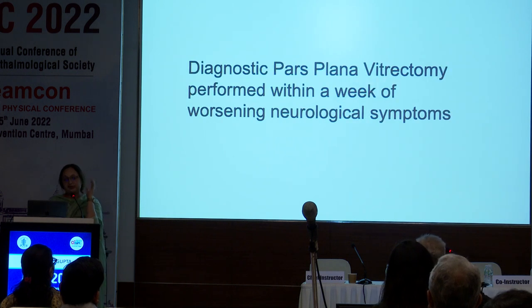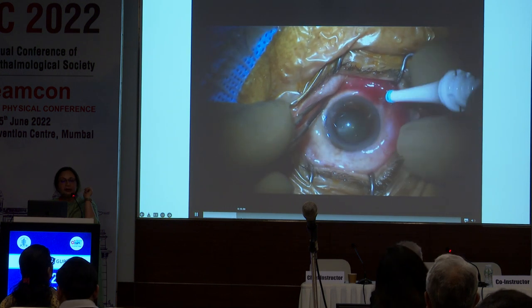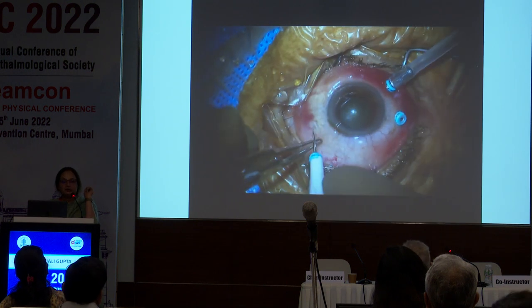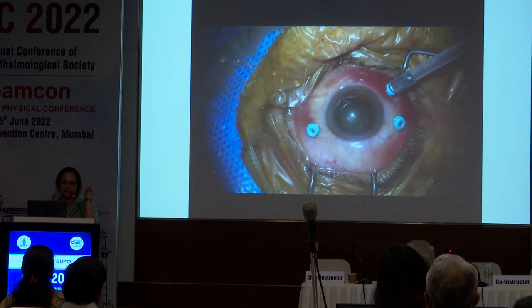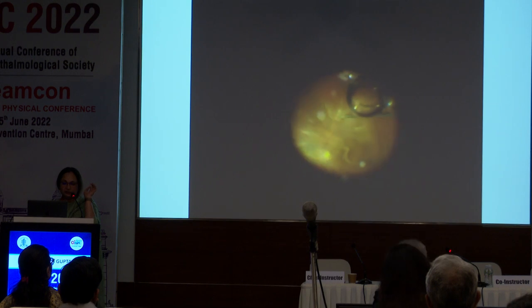Now they come to us, they are more serious this time, and we have to do vitrectomy, or kind of make the diagnosis for her. So what kind of diagnosis would you make? There is no way you will take out that RPE or something for biopsy. So the very simple technique, which Manisha has elegantly shown, I will just add a few tips without repeating what she has done. When you are doing biopsy for lymphoma or anything, infusion, she said, put the air on. I always do that.